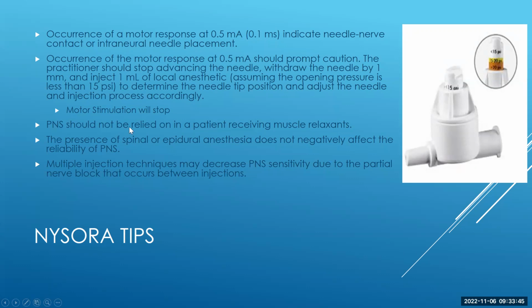Peripheral nerve stimulation should not be relied on if the patient is receiving muscle relaxants. That's key. If you're going to do it under general anesthesia and they receive muscle relaxants, you can't rely on that.